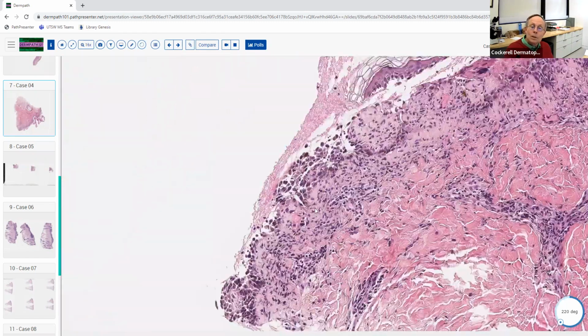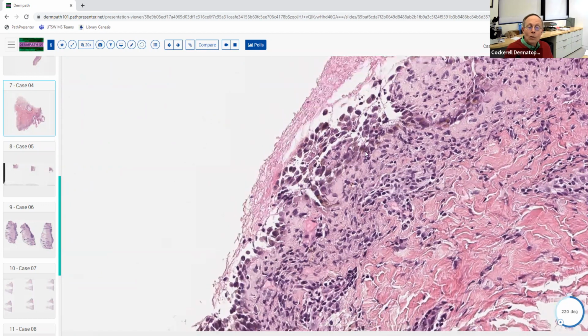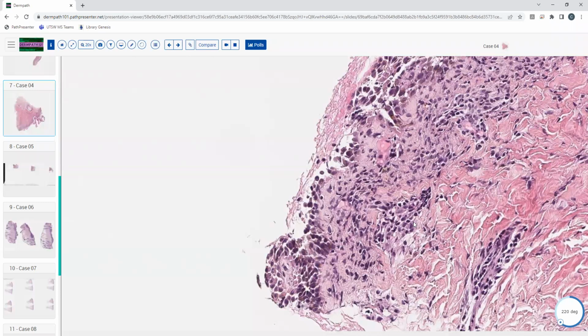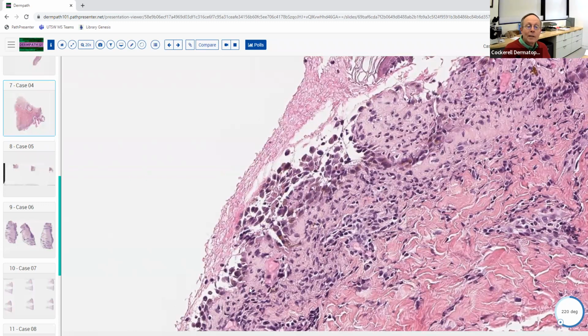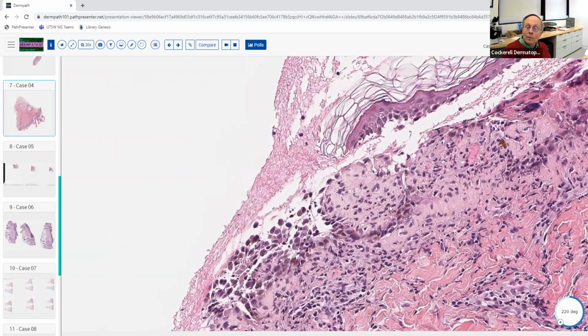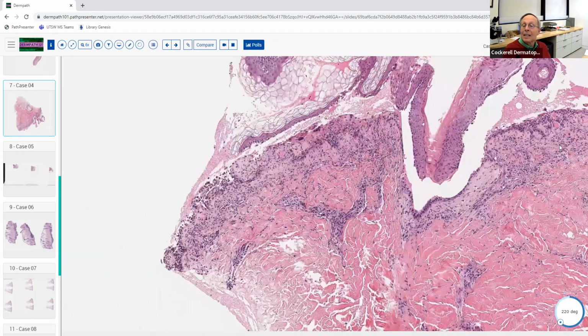So you're seeing this pattern here, which you said was acantholytic, which it is. What's the most likely diagnosis here? With this acantholysis, it makes me think of Hailey-Hailey, but I think you could also think of pemphigus vulgaris. I'm glad you said Hailey-Hailey, because if you just saw this field, you might say, oh my goodness, it looks like a dilapidated brick wall. That's what you see in Hailey-Hailey. But then you look over here, there's a single cell layer, tombstones and whatnot. So when you're looking around, you have to find the area that looks the best.